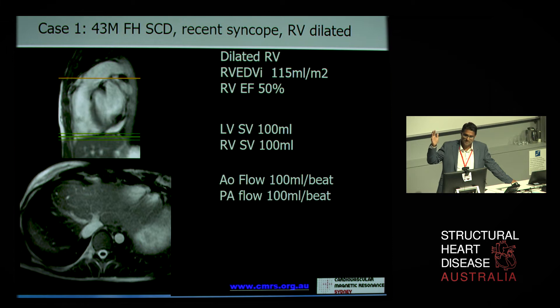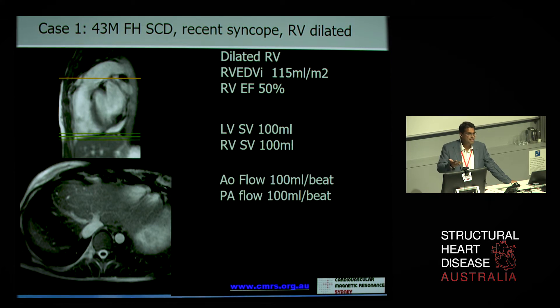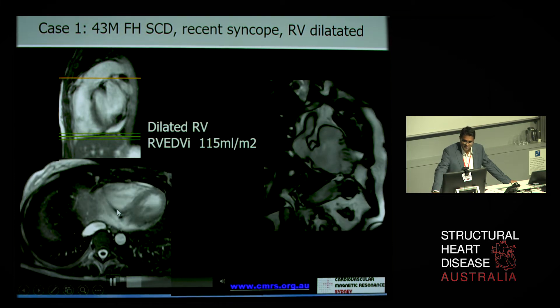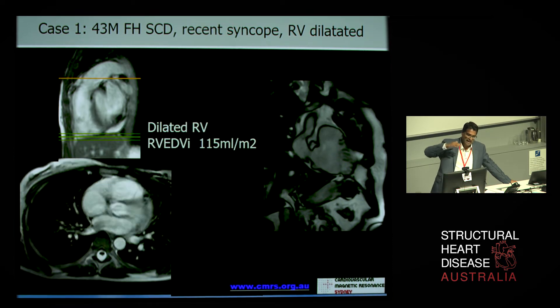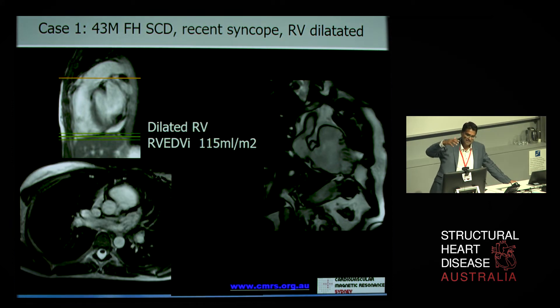The right ventricular end diastolic indexed volume is 115 mils per meter squared. Normally up to about 100 mils per meter squared would be acceptable, so this is probably 10 to 15% above normal — mildly dilated. The function of the right ventricle is normal. But there was a sense from the axial stack that towards the pulmonary artery, just in the right ventricular outflow tract, there was some unusual wall motion.